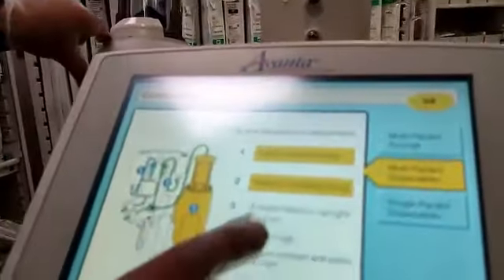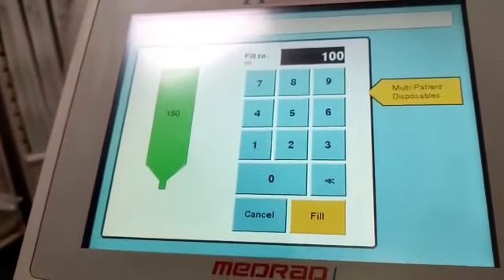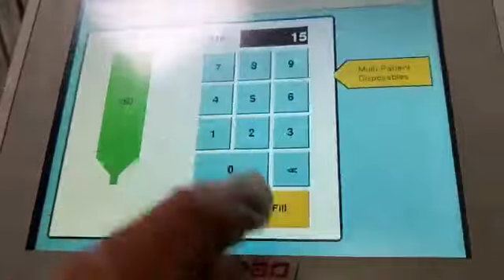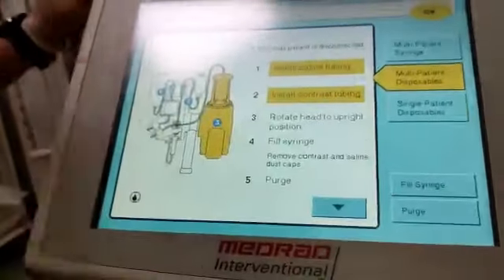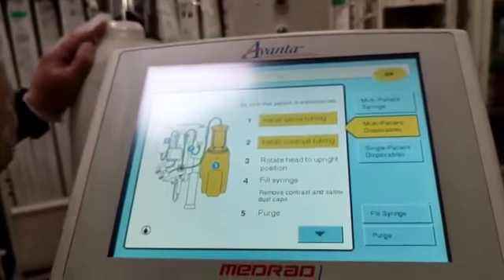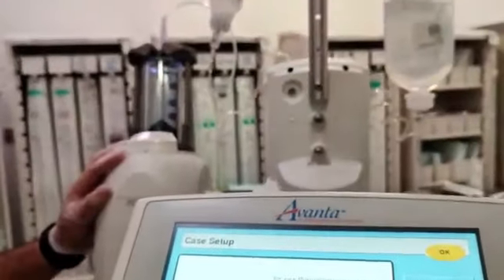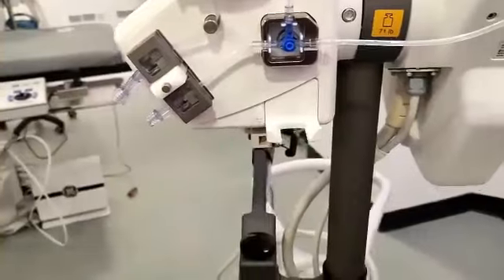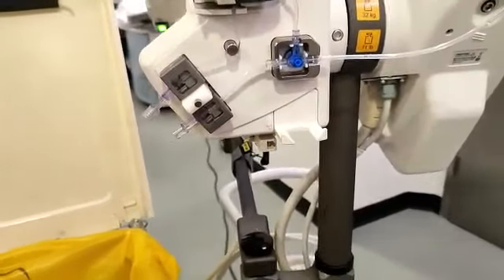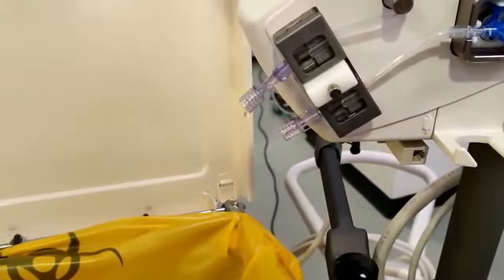The instruction asks you to rotate the head upright to remove the air and then fill the syringe. This syringe is around 150 ml, so you select 150. Once you press Fill, it will start drawing contrast — once it reaches 150 ml it will automatically remove air and adjust itself. The next step is the purge — purge means to make it air free. Make sure to put something down because contrast will jet out. Press Purge. Make sure it is disconnected from the patient when purging.